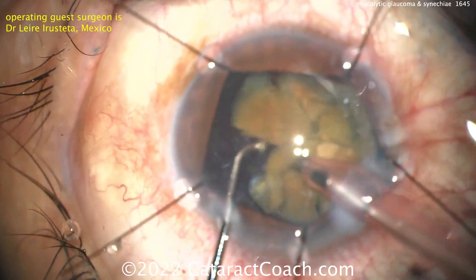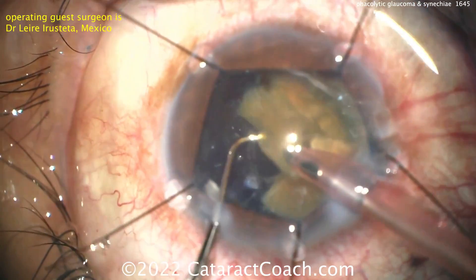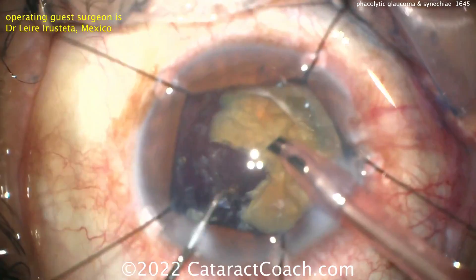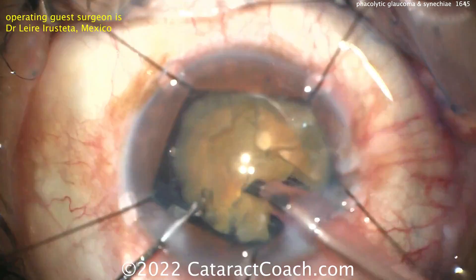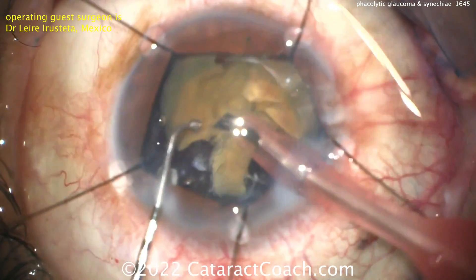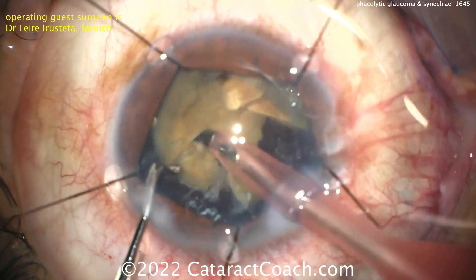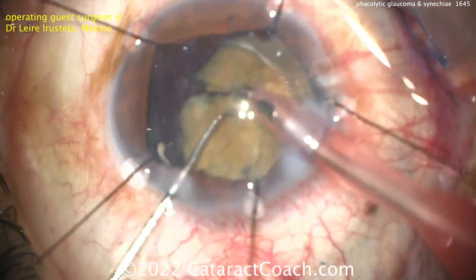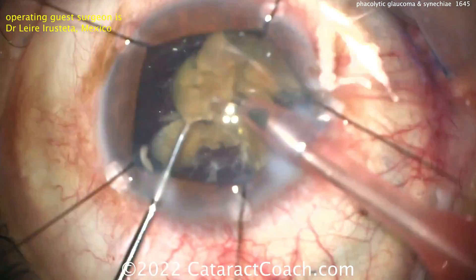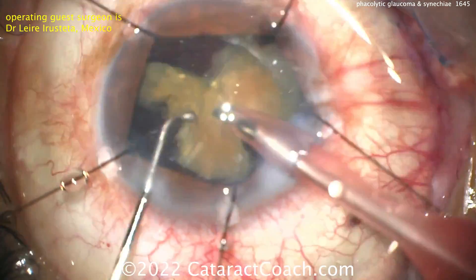The name of the game now is just taking your time to remove this. Notice how the pieces also tend to get stuck together in the middle — that central posterior part of the nucleus tends to be the densest and can even be fibrous. More viscoelastic — very smart. Extra dispersive viscoelastic is always a great idea. Then again, chop and more chop is the goal here. I like the idea of going to the periphery and debulking it first with small chops, because that dense central endonucleus is going to be the hardest part to remove and the hardest to chop. So debulk it with peripheral chops — even if they don't fully separate, just take your time, chop again, and you'll get them split apart.